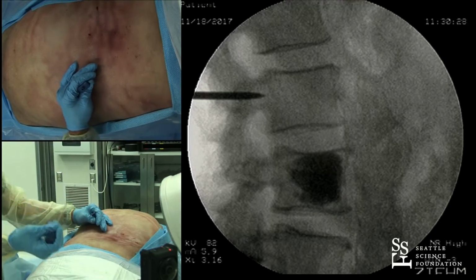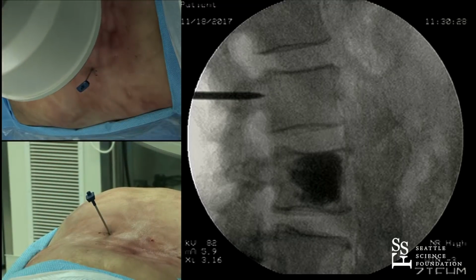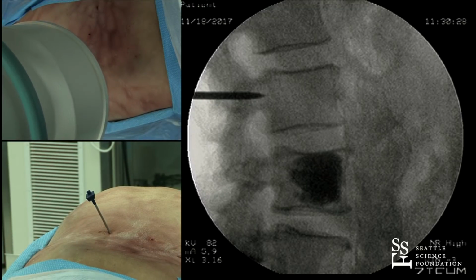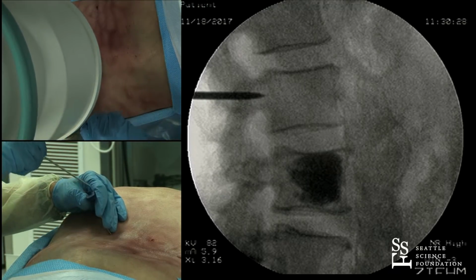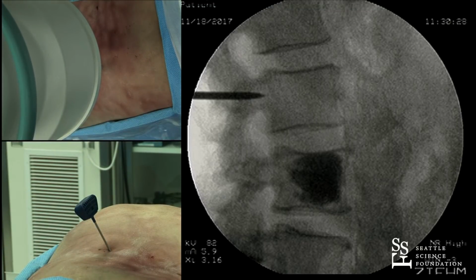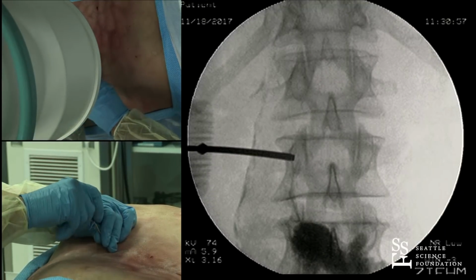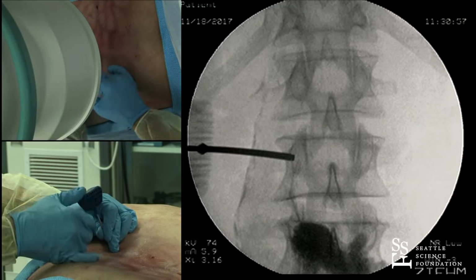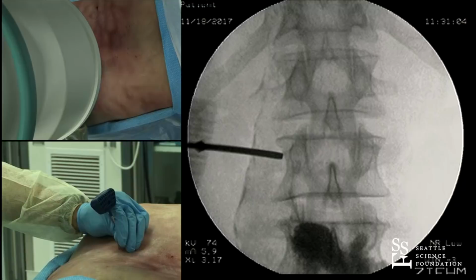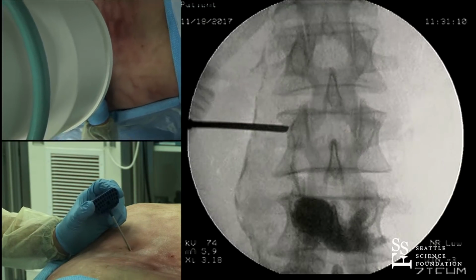So this is the single pencil point, the tri-bevel needle. So I'm going to switch this out and use the single bevel, since the pedicle is flaring toward us. That allows a greater margin of safety if the tip of the needle is under the ring on the AP. You know the bone is flaring away from it. Go a little bit more lateral until we get down to the appropriate depth. Maybe put a track to it.